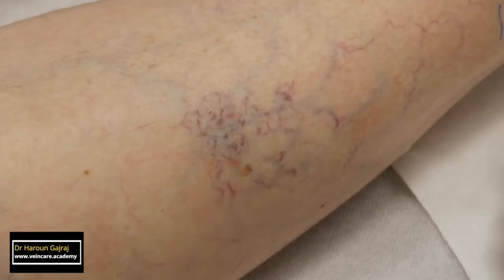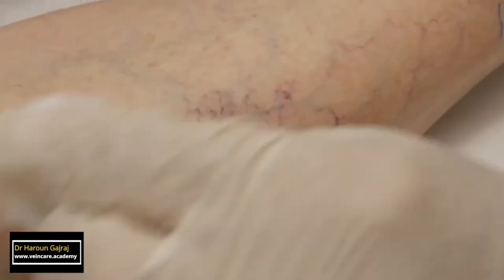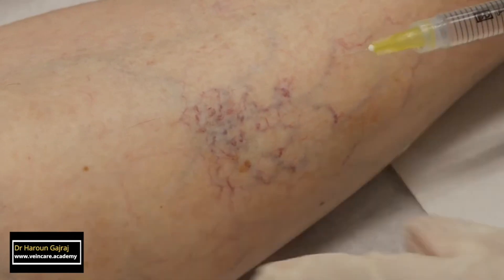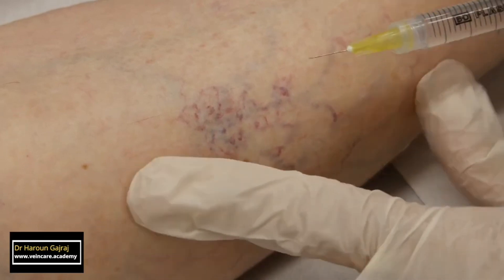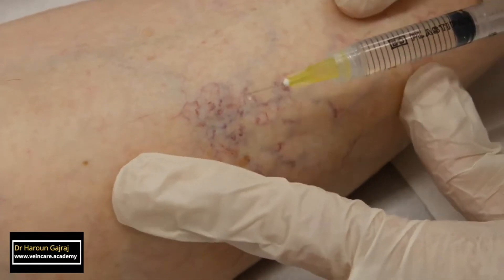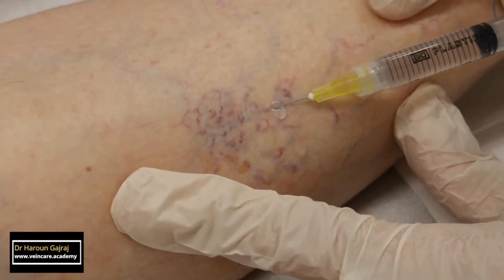I place the needle flat on the skin and slowly advance it while watching the tip. As I advance the needle, I apply a little pressure on the piston of the syringe. You can see a few drops of sclerosant leaving the needle tip even before the skin is punctured. Successful injection of sclerosant into a vessel is indicated by blanching of the vessels.